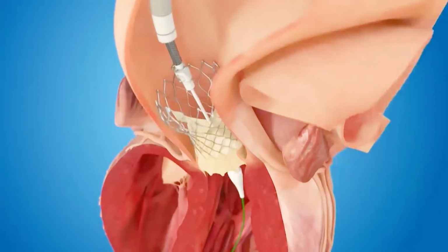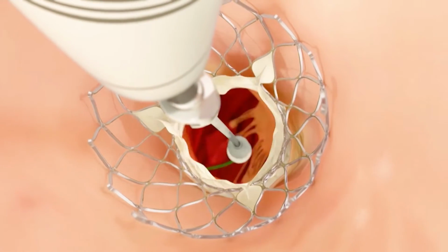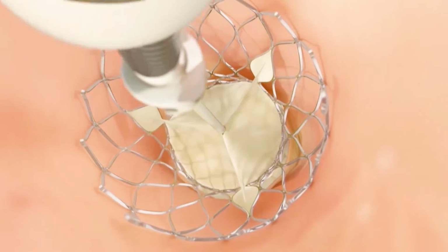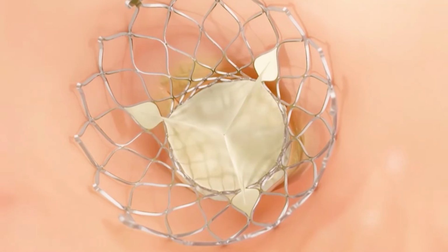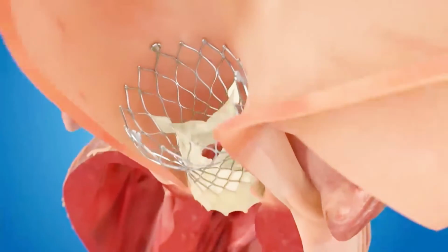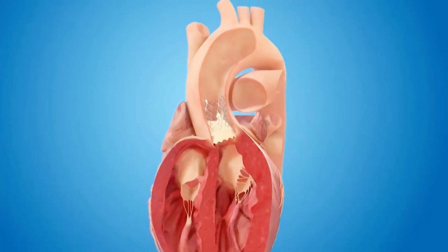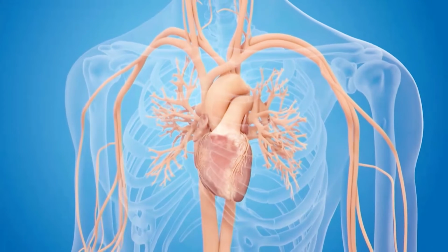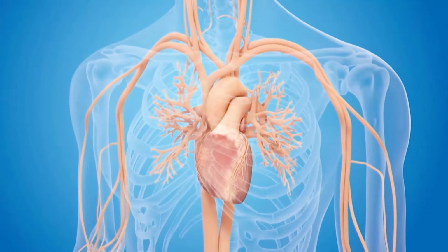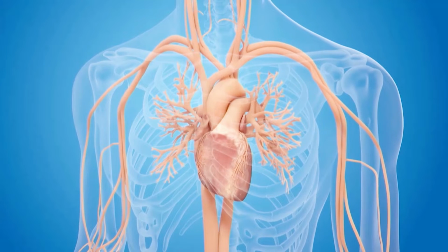And now you can see inside this cage a happy new valve, which happens to be a pig valve, which is essentially the same bioprosthetic valve that you would get if you had surgery. But here it is in a self-expanding metal cage. Don't worry, this cage is not going to rust. It's actually made of a chromium alloy, and it's not going to set off any metal detectors.